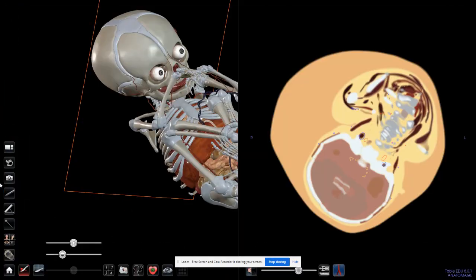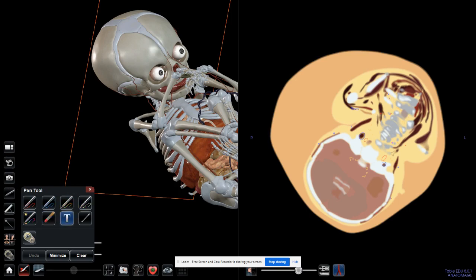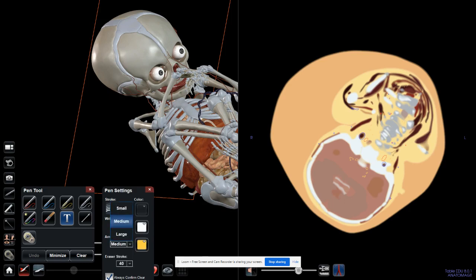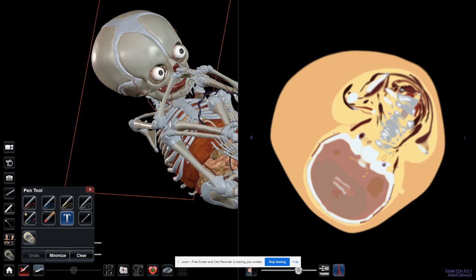Back to the Anatomage Table. As you can see, this is the pen tool. If you are explaining something to your students or peers, you can use any of these pen options, the colors, and the text as well. If your handwriting is not very readable, you can adjust the pen settings, the text, the arrows, the eraser stroke, how big or small it is, and so forth. Each option can be minimized, cleared, or closed.